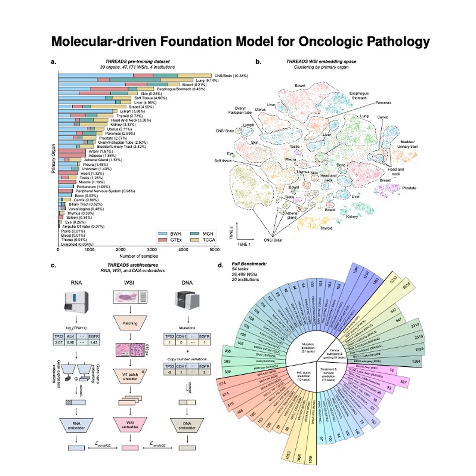But the input data for just those 100 samples is absolutely enormous. We're talking whole slide images, WSIs, gigapixel images, vast amounts of visual data. Trying to train an AI model to find some tiny, subtle visual clue hidden in a gigapixel image, a clue that correlates with a really rare outcome, when you've only got maybe 50 examples to learn from, is basically impossible with traditional methods. The model just overfits immediately. It memorizes a few examples instead of learning a general pattern.